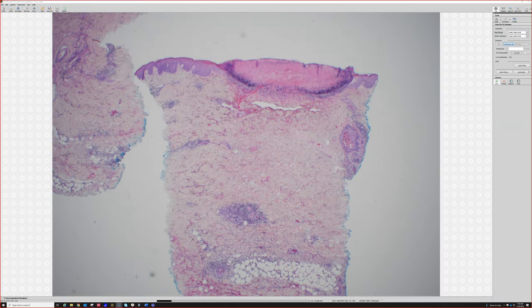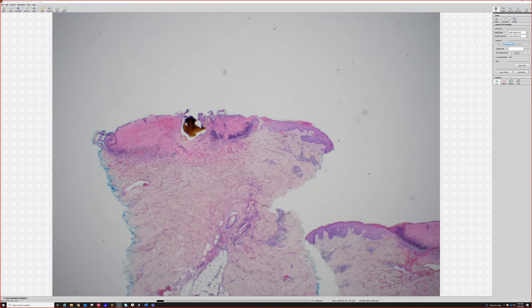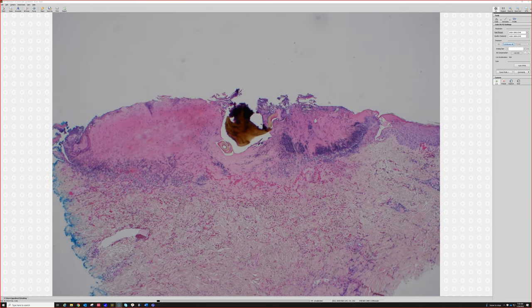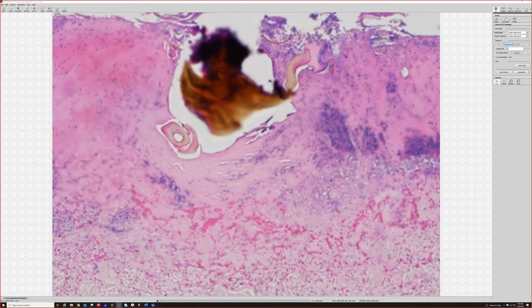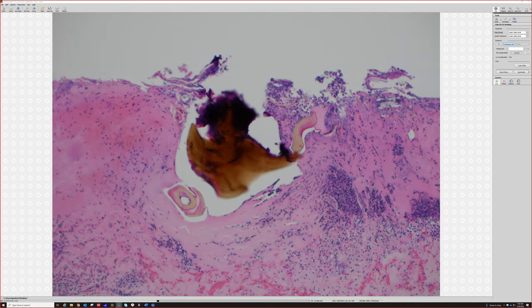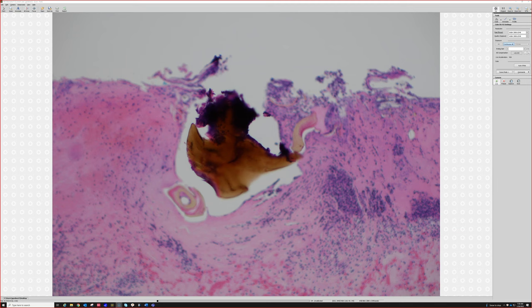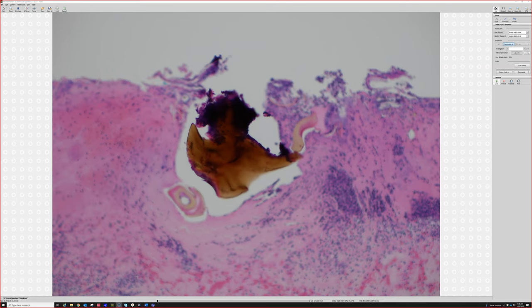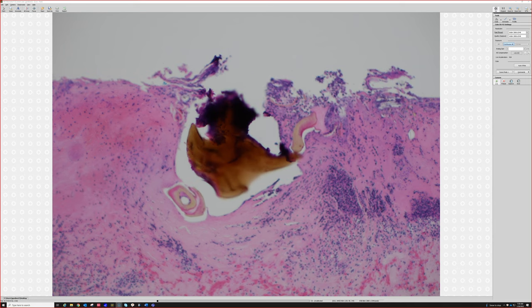Here's one in punch biopsy — some deep inflammation, an ulcer, and then something here. It's kind of thick. See how when I focus up like this, you can see it in focus and the rest of the tissue is out of focus. That three-dimensionality is one thing that, as much as I love digital slides, digital slides don't do really well, at least not without extra help. It shows me that this is a thick piece of something in here, thicker than the tissue itself.